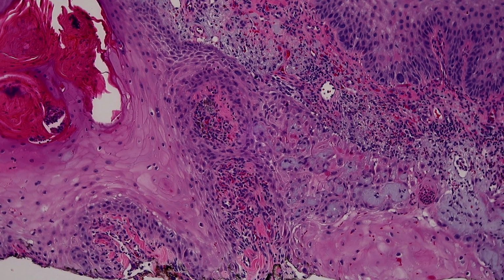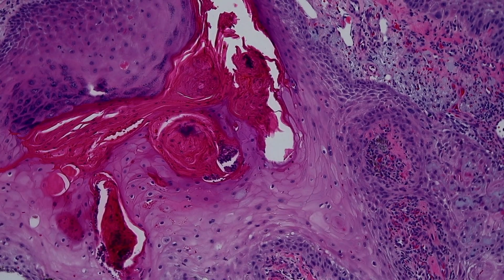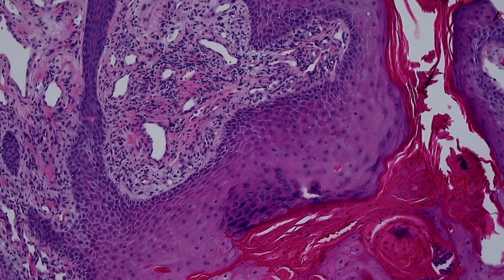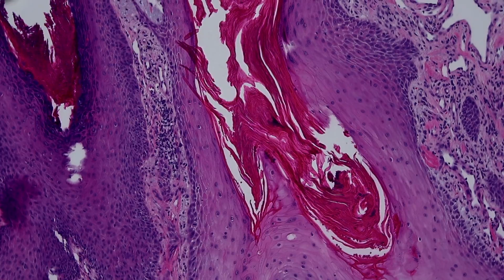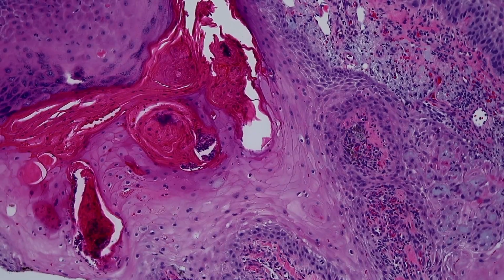Now here, I'm pretty sure this is a squamous cell carcinoma, but it's worth thinking about when you see big glassy expanded areas, and when you see little clusters of neutrophils. That's a thing that I sometimes see that can make you think about infection. I see that in squamous cell carcinomas all the time as well, but I always want to stop and think, could this be infectious? Is there any chance that it might be? And those are times where doing infectious stains might be helpful, depending on the situation.